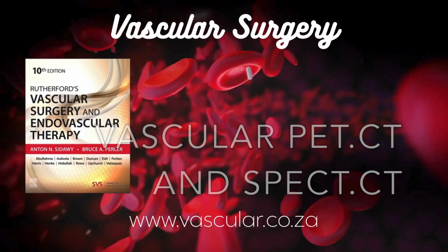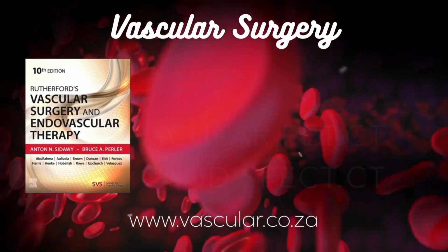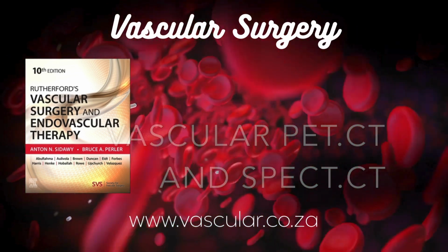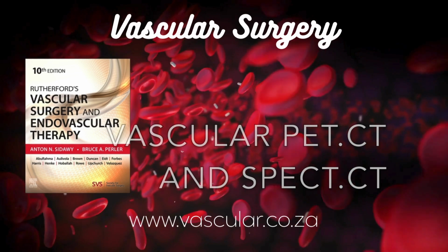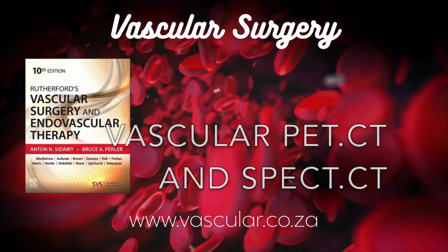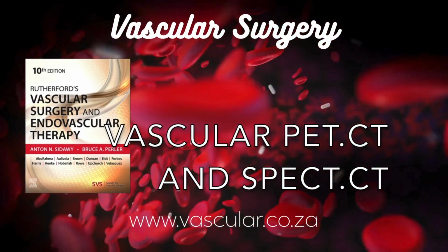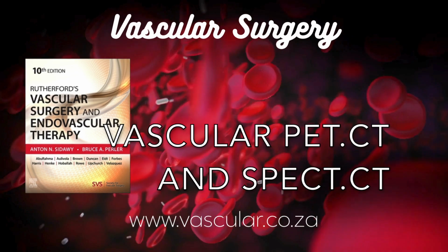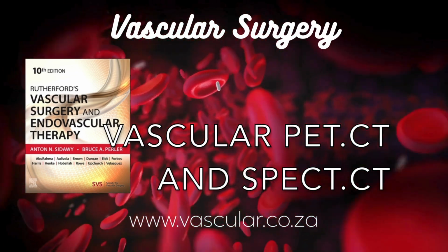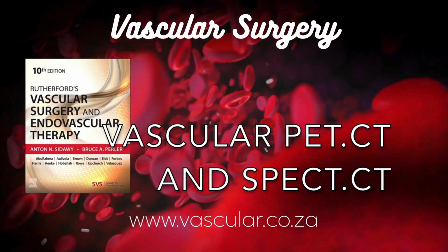Hybrid PET/MR is really interesting. MRI gives amazing soft tissue detail without using ionizing radiation like CT does. Combining PET sensitivity with MRI's anatomical and functional capabilities holds a lot of promise, especially for things like plaque characterization or imaging the heart and brain. Early studies comparing PET/MR and PET/CT for carotid imaging show good agreement. Less radiation, potentially more information.